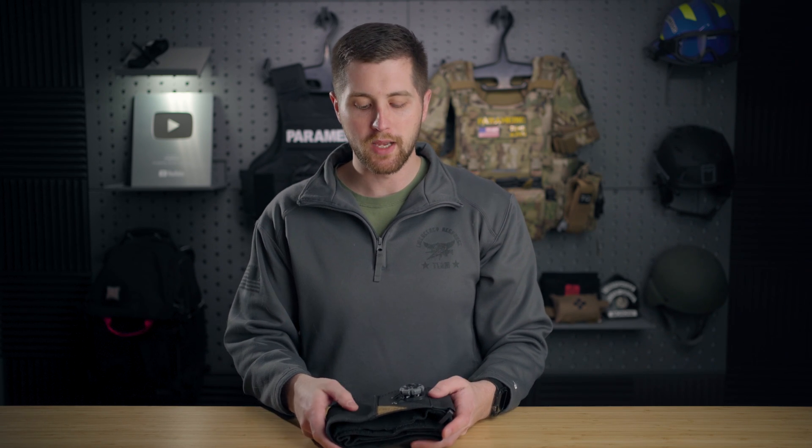Hey guys, my name is Sam and welcome to PrepMedic. This week's video, we're doing a full review and walkthrough of the Generation 2 Pelvic Binder by Crow Medical.